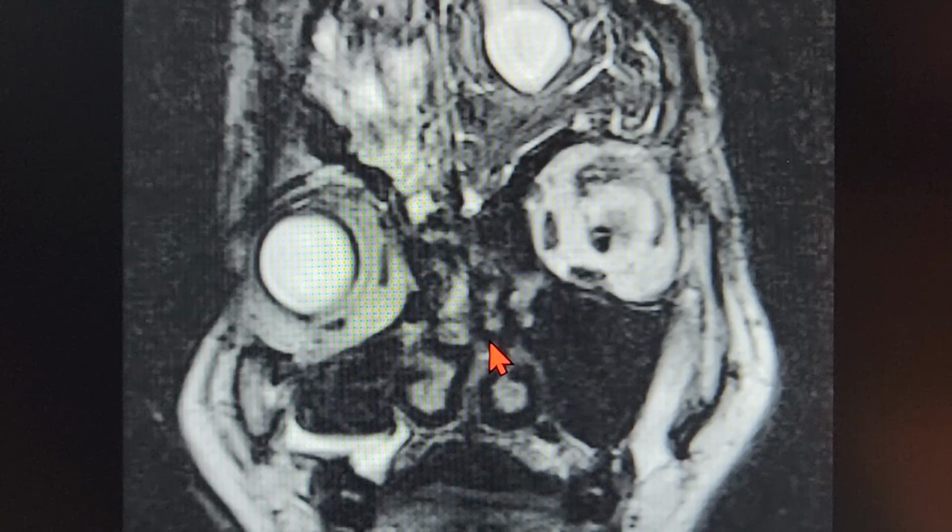So I'm going to shift on to the patient's surgical video right now. And I'm going to be showing you each and every aspect of the skull base anatomy, how to do a full house FESS, how to do a Draf, how to do an extended hemi-Lothrop, how to use a 0 degree and the 70 degree for your frontal sinus surgeries.